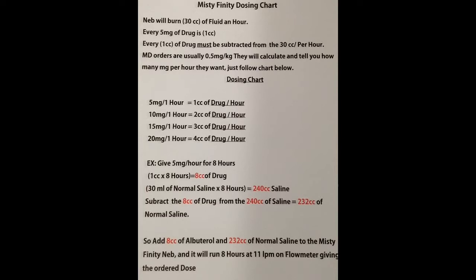So what you want to do next is add your eight cc's of albuterol and your 232 cc's of normal saline into the Mistyfinity neb. Turn the flow meter on at 11 liters, let it rock. You've given the proper dose.